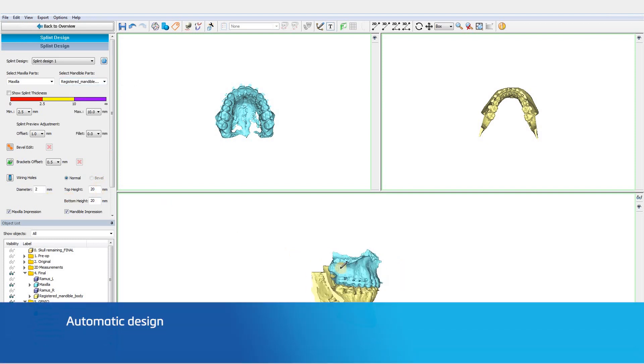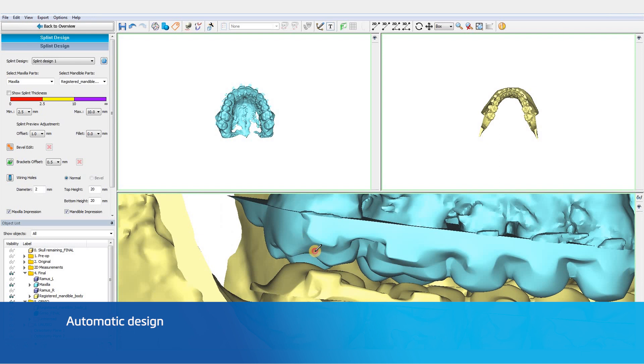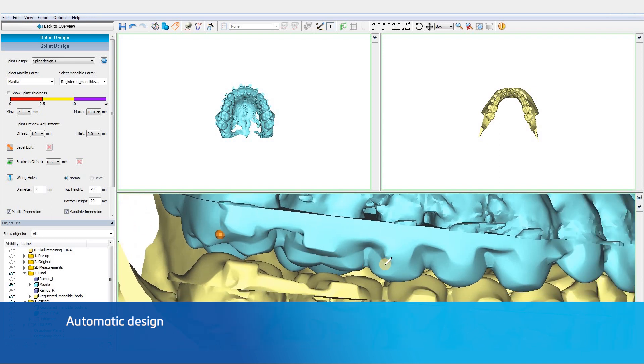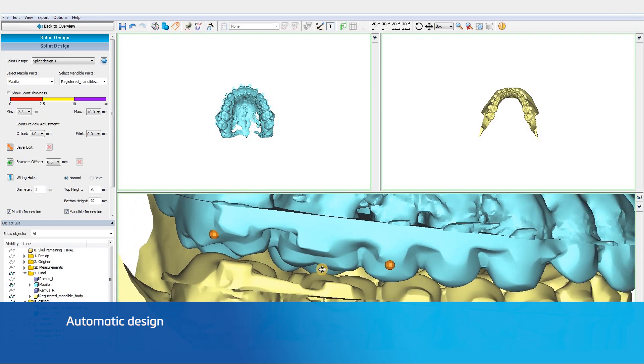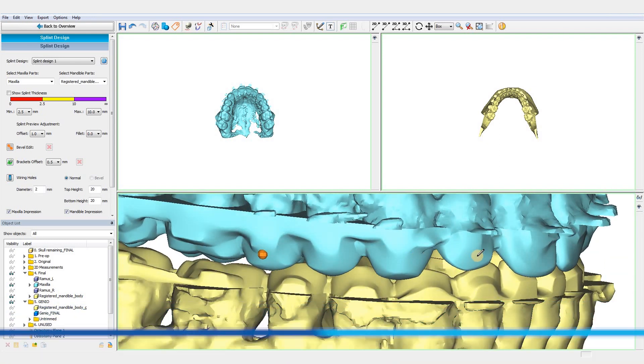The first step is to indicate points on the teeth to outline the splint. The software will automatically calculate the splint design.